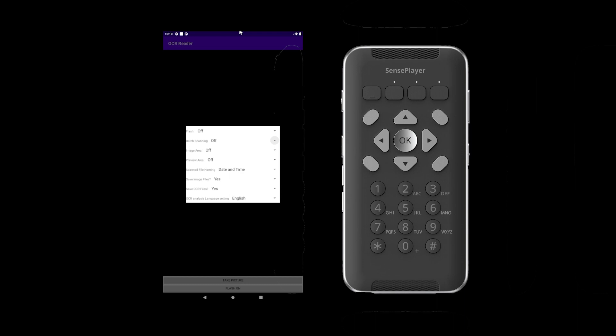You can choose between off, manual, and one-second increments from 5 seconds to 9 seconds for auto capture, using the left and right arrows. When this option is off, pictures are captured, recognized, and saved individually. If set to manual, capture the first image by pressing OK, then capture each subsequent image by pressing the number 1 on the keypad. Scans are saved in a continuous file until you analyze and save them by pressing OK. If you set batch scanning to one of the time elements, the Sense Player automatically captures an image at each specified time interval and saves the scan to a single file. Initiate recognition by pressing OK.